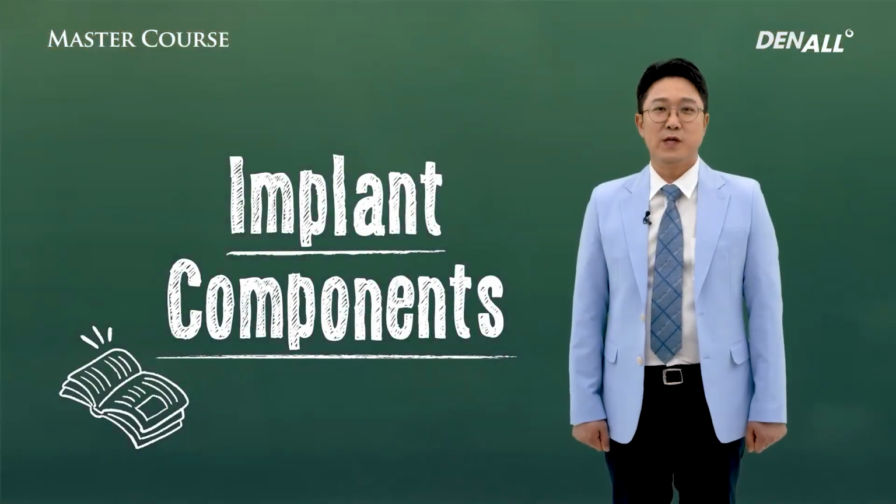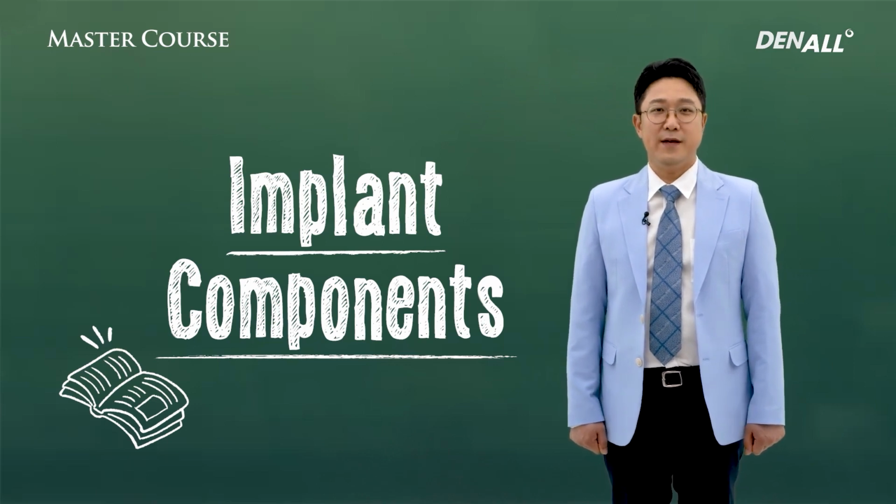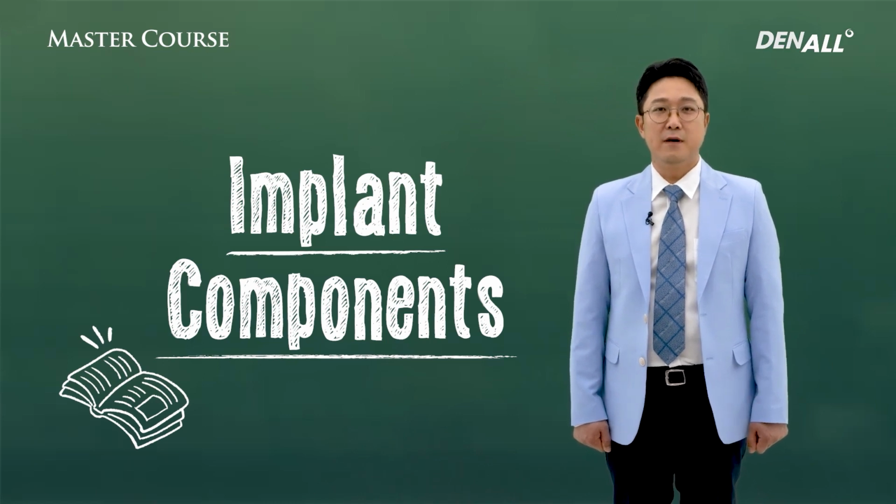In order to perfect things, you need to understand the composition. If you add your skills to that, you'll be able to get good results all the time. Before we move into implants, let's look at the composition of implants. The contents.